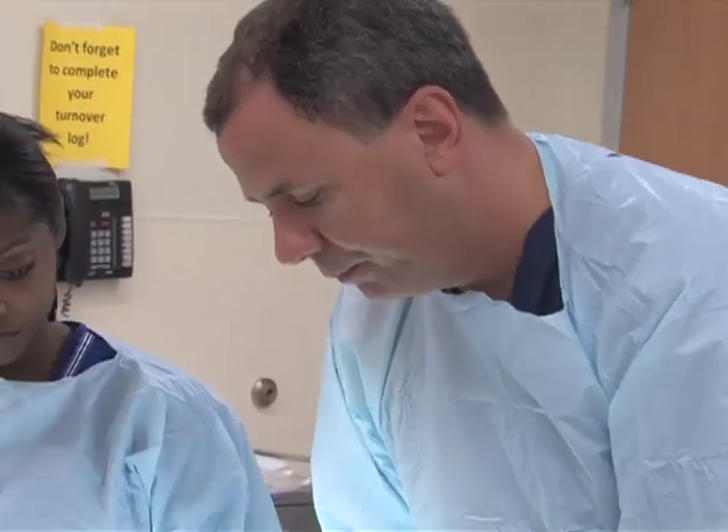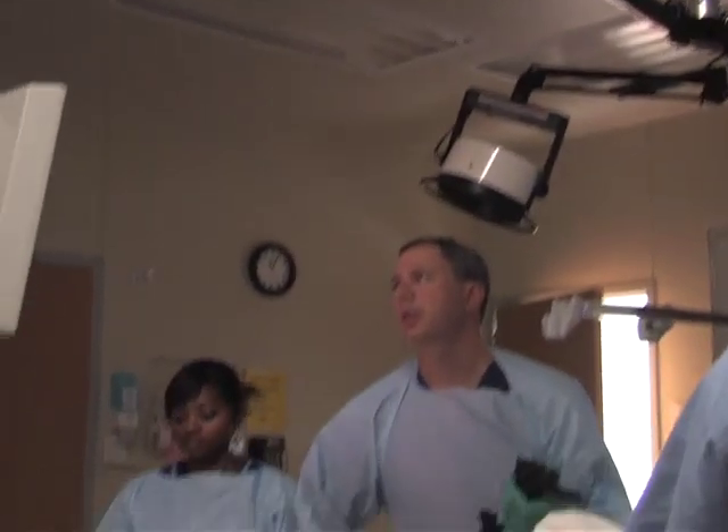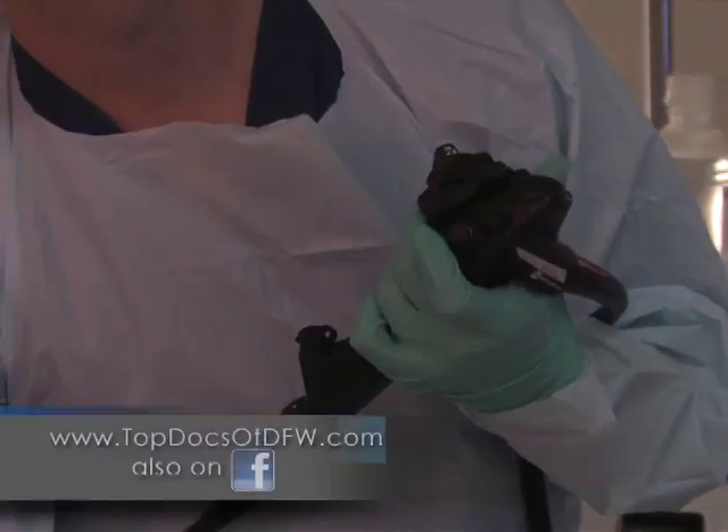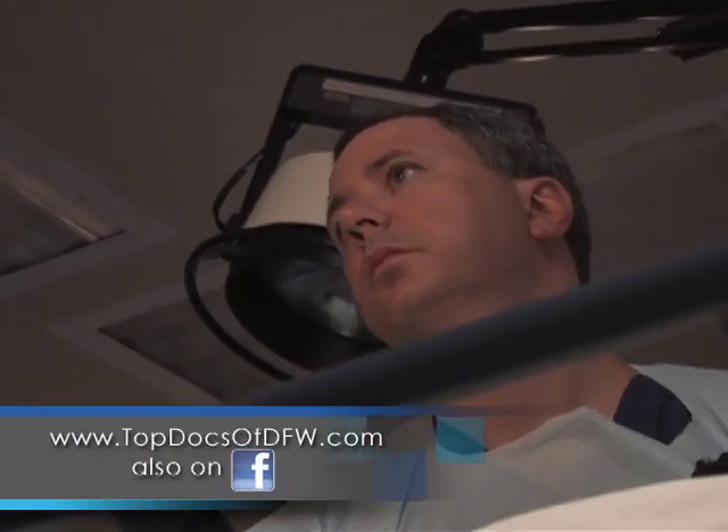He says we're going to do this one, two, three and it's going to be over. Simple procedure, over very quickly — five minutes, it's done. The recovery period is very minimal, usually about three to four hours of swelling, feeling as if you have something inside the anus area, feeling like you have to have a bowel movement and nothing needs to come out. It's just really the hemorrhoid being treated with the rubber band. Once the hemorrhoid falls off, that swelling sensation goes away and people do just fine.